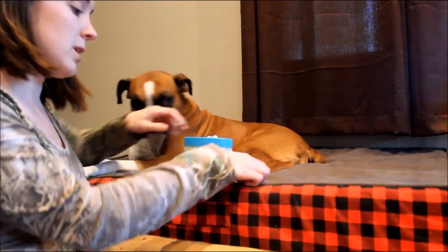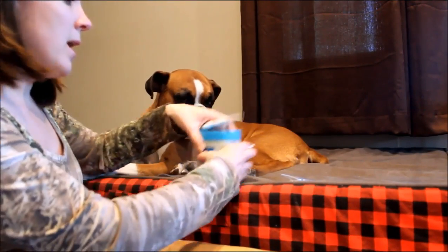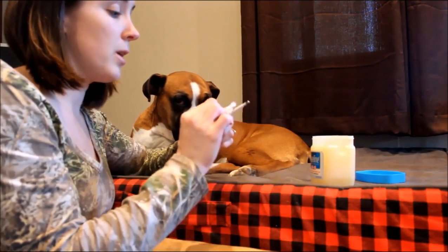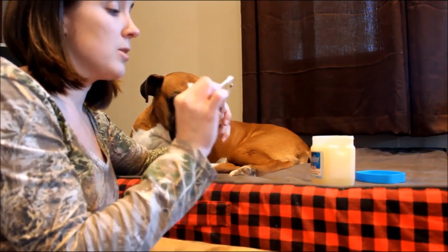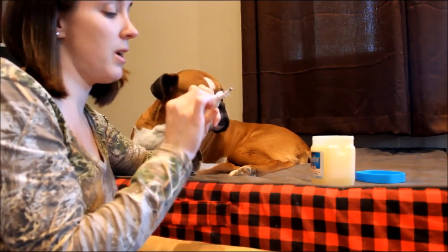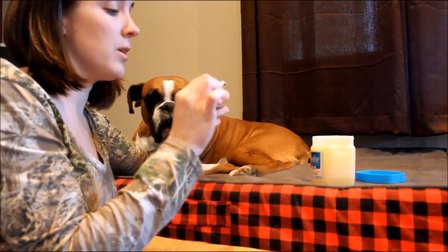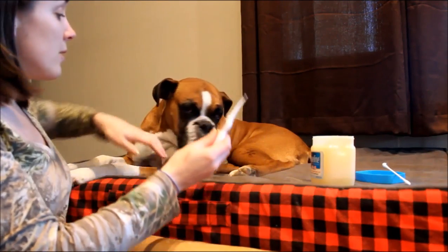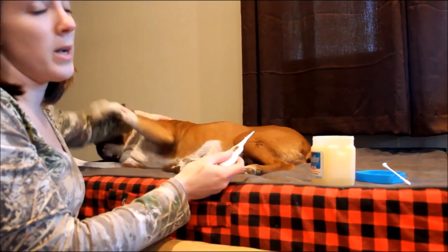So now I'll show you how to take a dog's temperature. We have a separate digital thermometer, and I'm just going to open the petroleum jelly, get a little bit on the Q-tip, and rub it so that it coats the thermometer — you don't need a big thick coat, just a little thin coat. Then you're going to insert it into your dog's rectum about one inch.